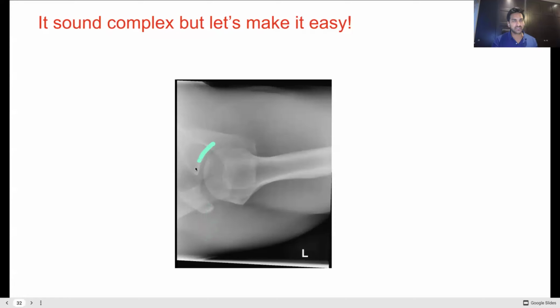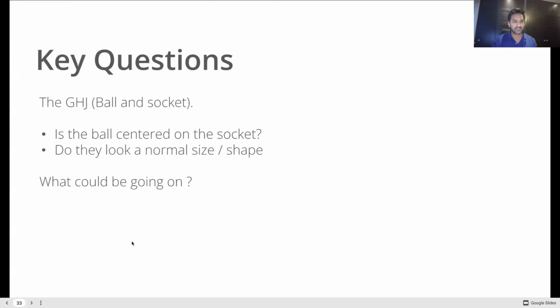But over here, you can see the glenoid, and you can also see the humeral head. It's a bit like a golf tee. Imagine if you had a golf ball sitting on a golf tee. That's essentially what you're looking at. The golf ball is sitting nicely on the golf tee. It's all aligned quite nicely. Therefore, this is not a dislocated shoulder. So this is all good news. We've got the anatomy slightly down.